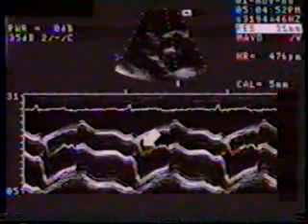The aortic cusps are normal, with slight fluttering of the right cusp evident. The membrane is also clearly visualized. M mode of the aortic valve is illustrated here. Note a very typical abnormality involving the right coronary cusp. There is early systolic closure, very typically seen in this condition. We will show this in real time now.